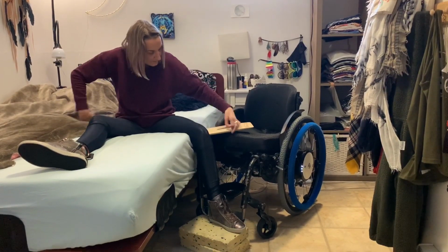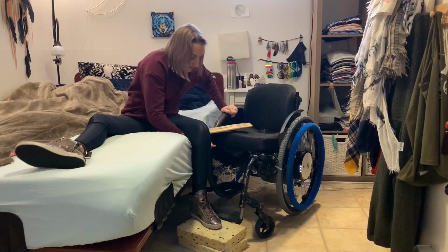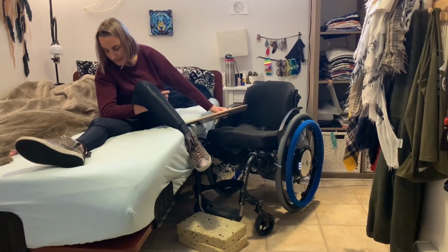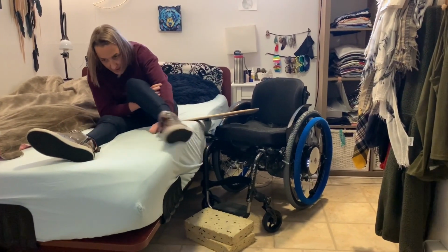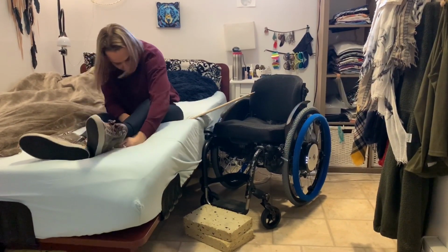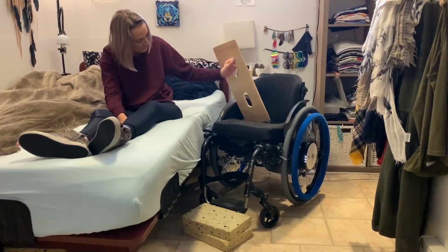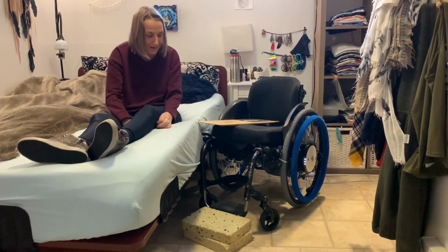This one, and then the same thing with the other one here. Use my elbow, wedge my elbow onto my other leg, which helps to have a little bit more base of support. And there you go, that's transferring onto the bed.